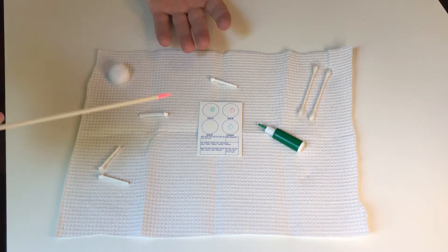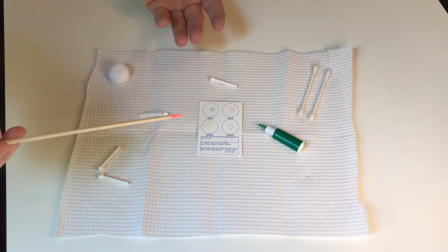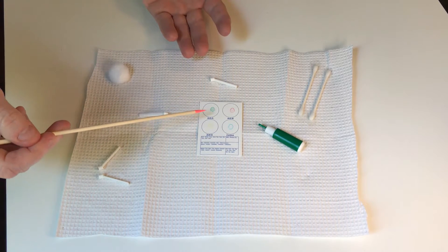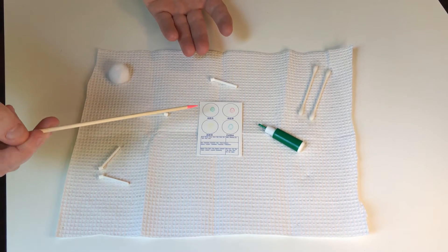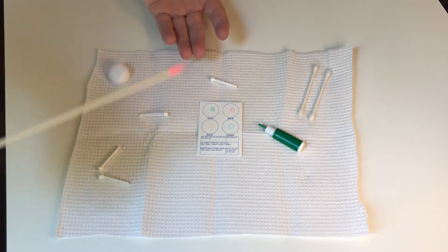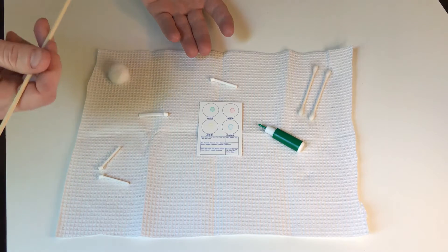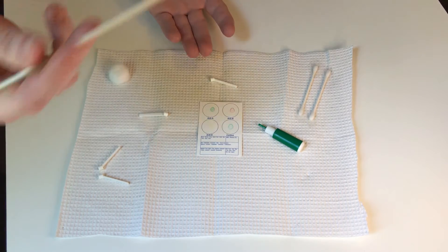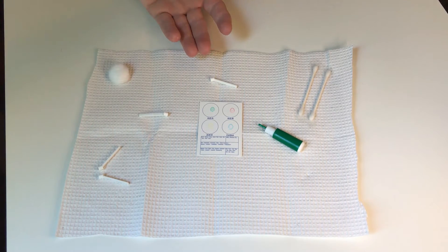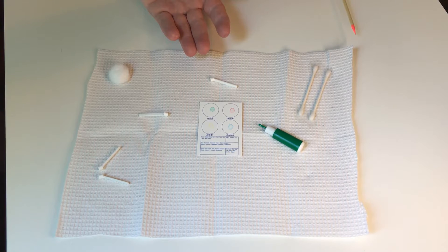Here we have a blood type test. I'm going to do it on myself. We have a card that already has four little circles on it, and each of these circles has an antibody to a particular antigen that is found on blood. It's a test to see if you've got the particular antigen.